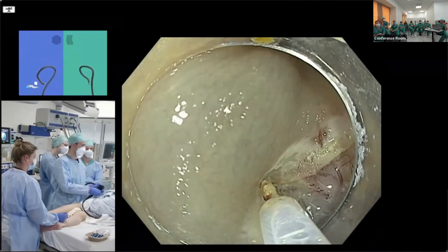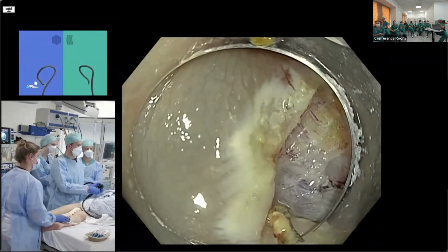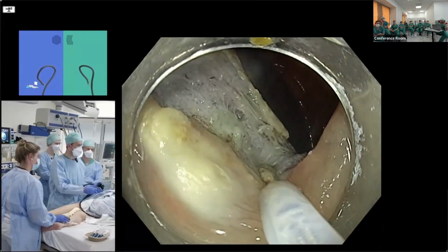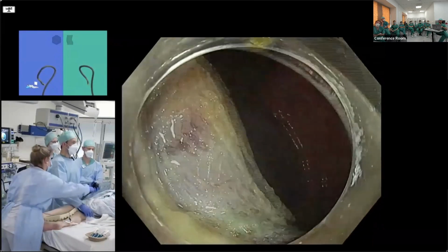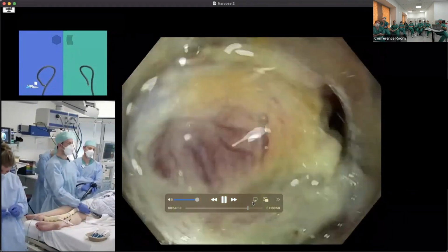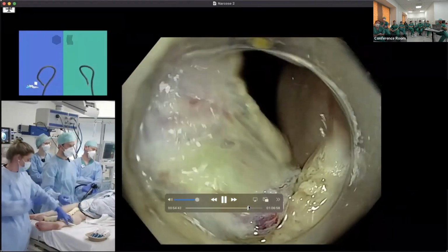In the validation studies of this technique, the incomplete margin ablations have recurrence rates up to 25%. And the ones that have complete are 1 or 2%. So make sure it's complete. And what we mean by complete is what this looks like a really decent 1 to 2 millimeter rim of white all the way around the defect. You also nicely assessed the submucosa and found it to be not necessary for treatment. So well done, Charlotte.